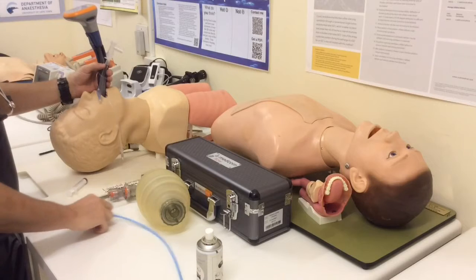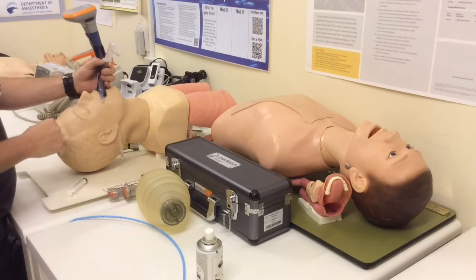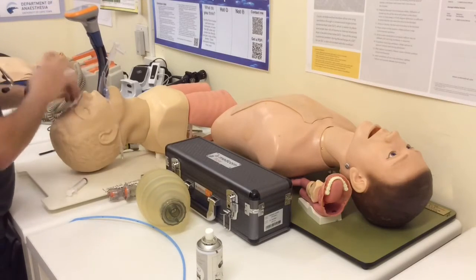In the situation where even that is tricky, I can always put a flexible fibroscope or a bronchoscope down here, and I can do a video-assisted fiber optic intubation through a supraglottic airway. That's a lot of tech.